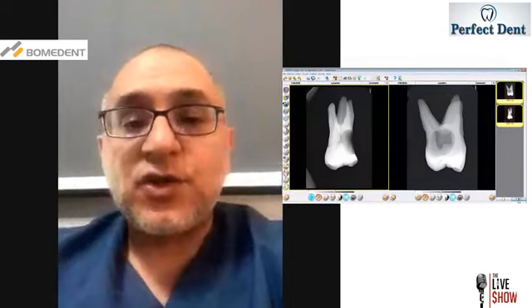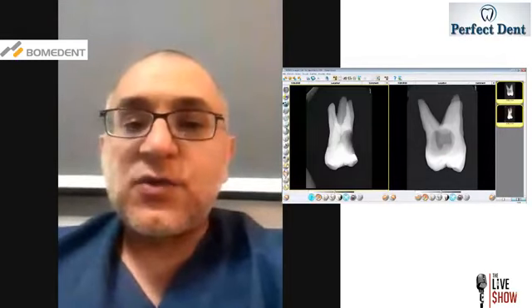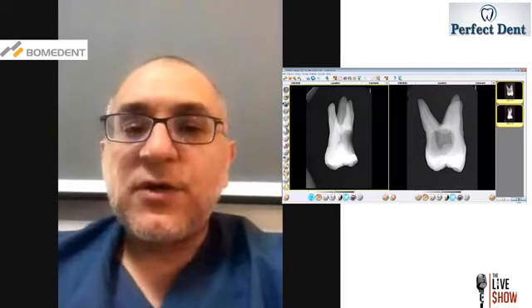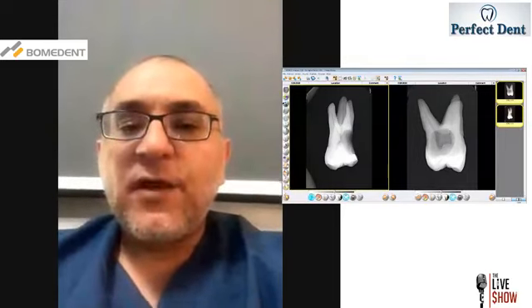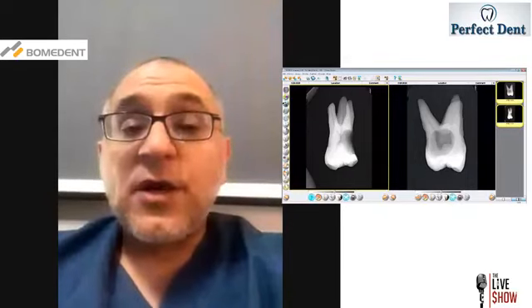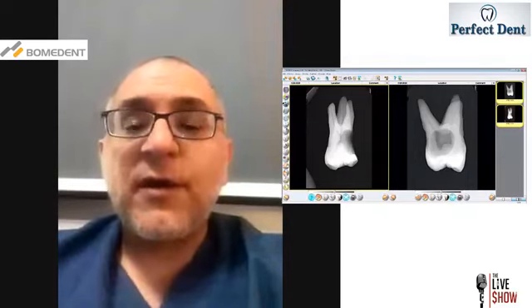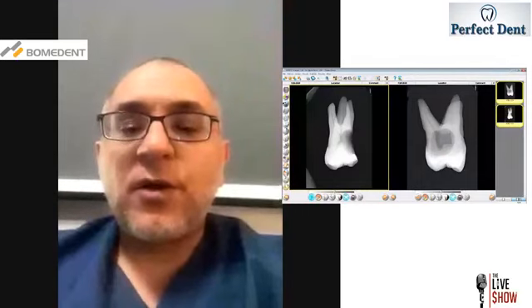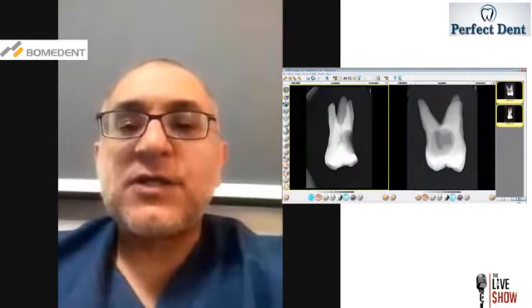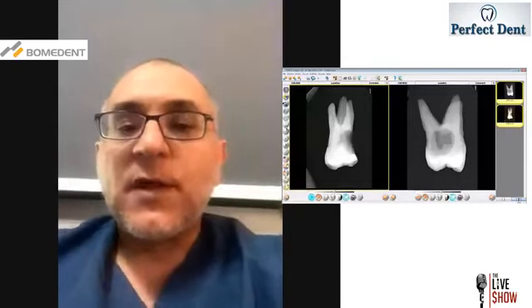So the only way for you to negotiate narrow canals is to use small instruments, pre-curve your instrument, and begin to ease the instrument into the canal very, very lightly. Don't take too much. Don't try and force and rotate the instrument a 360-degree rotation, a very mild 15-degree rotation, clockwise, counterclockwise. Come out, irrigate, and keep on doing this until you reach the full working length.